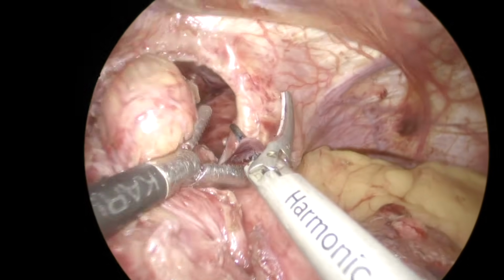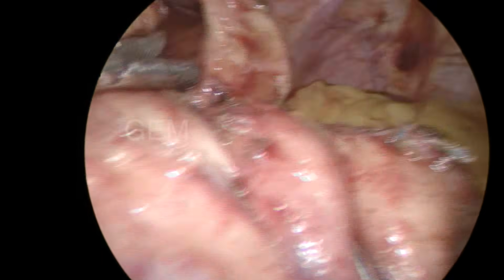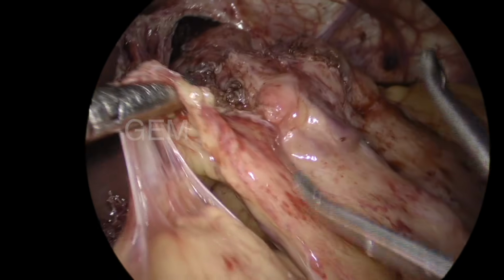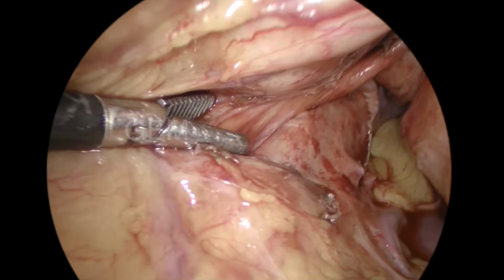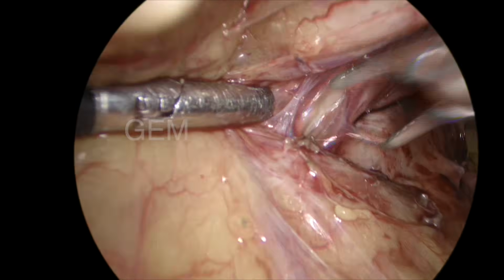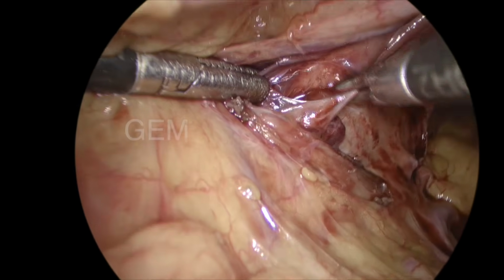Again, you can see I am looking at the left side behind the esophagus, and then coming to the right side, on the lateral side of the esophagus. I want to see the edge of the end of the fundus, but I couldn't see it. I don't know why the previous surgeon dissected so much on the lesser curvature side. You can see the big window in the lesser curvature. Posteriorly, the stomach wall is going down, and I am not seeing the edge of the stomach wall.